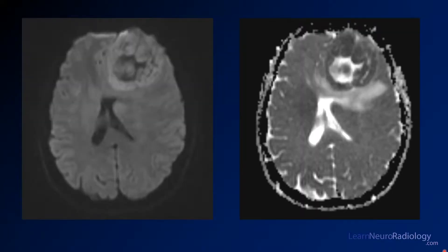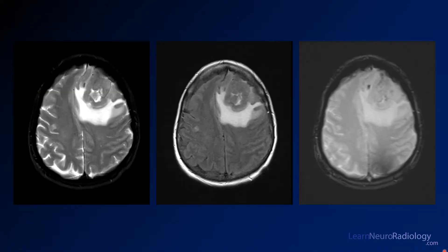The patient went on to get an MRI. This is diffusion and ADC. Here you have a selection of additional non-contrast images — T2 on the left, FLAIR, and gradient echo.